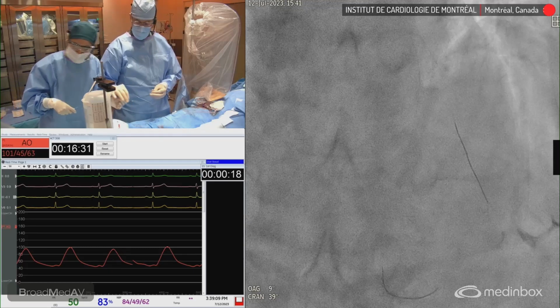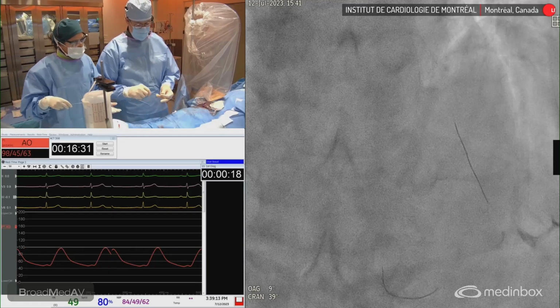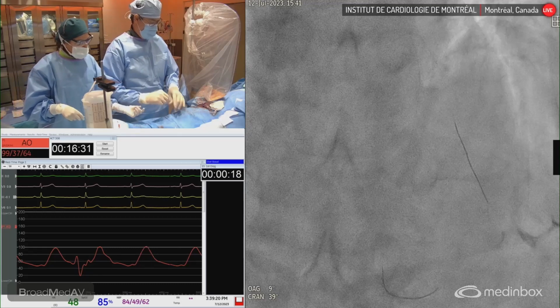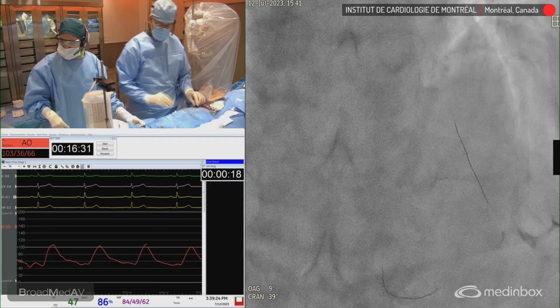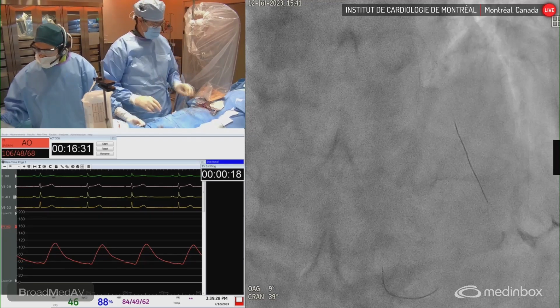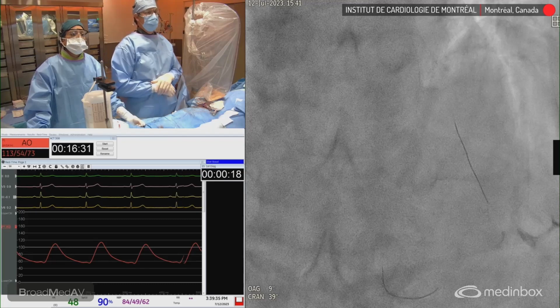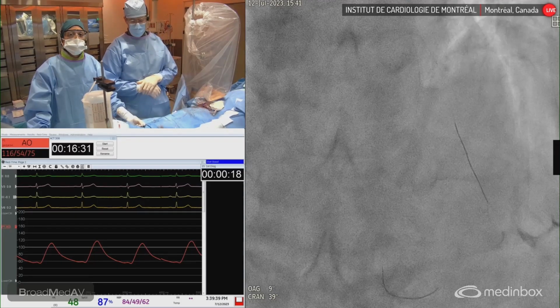So this technology, again, with the shockwave, is lithotripsy. It's, of course, a very useful technique. Once again, it does not work in all cases that you would like it to work, but we're going to see if it's going to do what it's supposed to do, and that is cracking the resistant lesion in the proximal diagonal branch. We'll just need to connect, and then we can inflate. So once again, we need to connect the system, make sure it's functional, and then we go in.